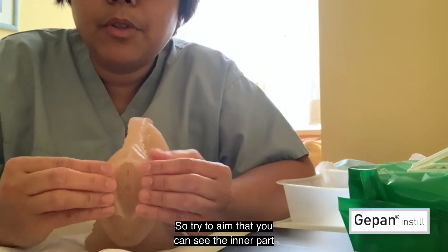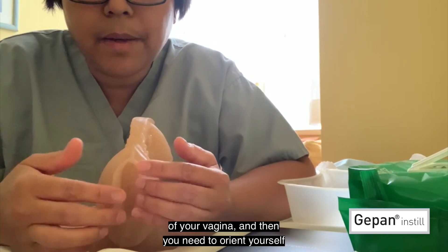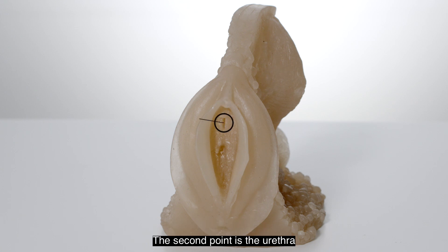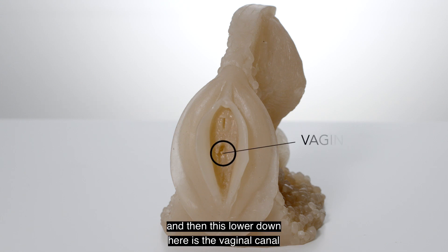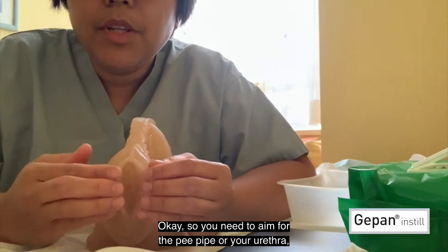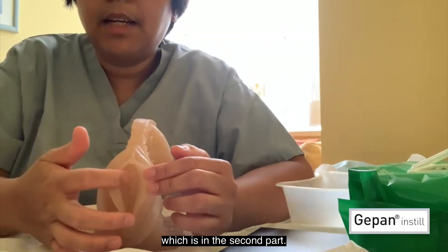Try to aim so that you can see the inner part of your vagina, and then you need to orient yourself to where the urethra is. This one is the clitoris, which is your clitoral hood. The second point is the urethra, wherein the catheter goes in, and then lower down here is the vaginal canal, and lower down is the back passage. You need to aim for the urethra, which is the second part.